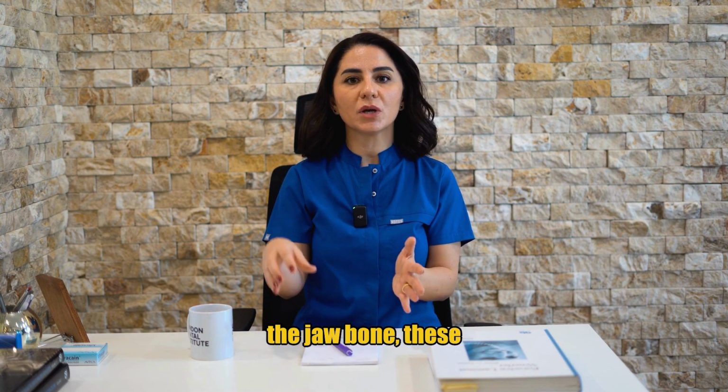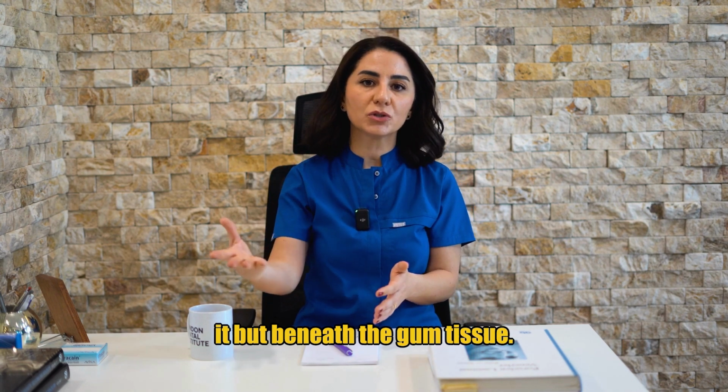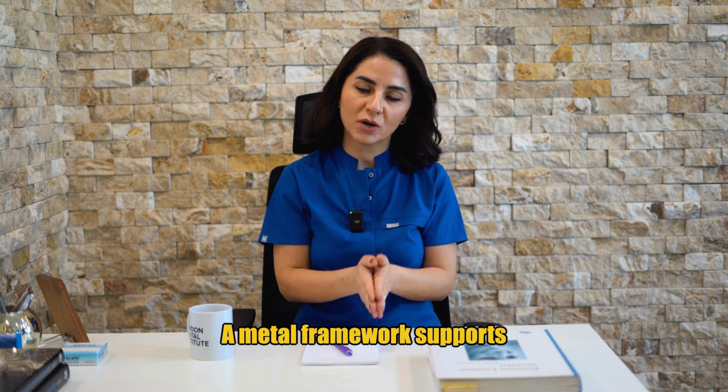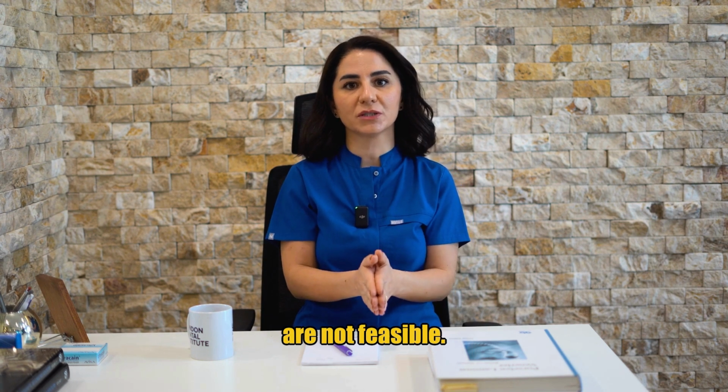2. Subperiosteal implants. For patients who may not have enough healthy jawbone to support endosteal implants, subperiosteal implants provide a viable alternative. Instead of being placed into the jawbone, these implants rest on top of it, but beneath the gum tissue. A metal framework supports artificial teeth and is often used when bone augmentation procedures are not feasible.